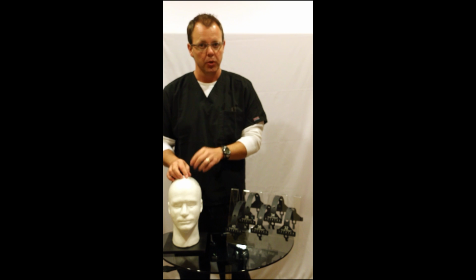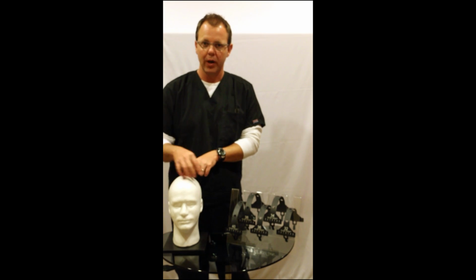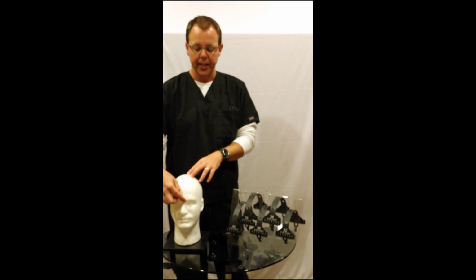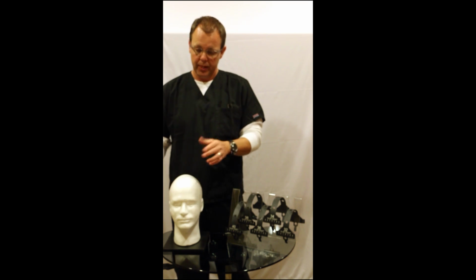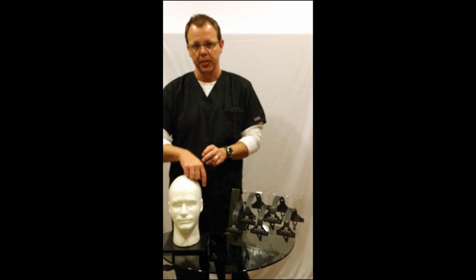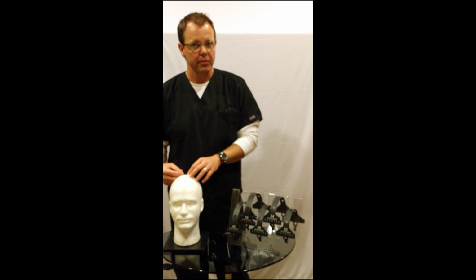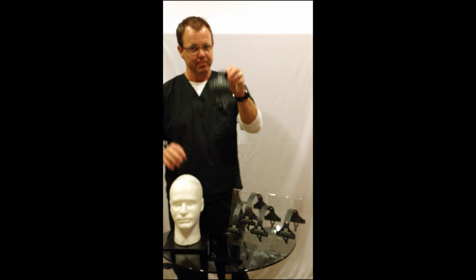Now, choosing your tool is going to be based off the distance of your Z line and your Y line. For example, in this case, the distance of the Z line is 34 centimeters. The distance of the Y line here happens to be 34 centimeters. And the circumference is 54 centimeters. So, since the Z line is 34 centimeters, I'm going to choose tool 34.